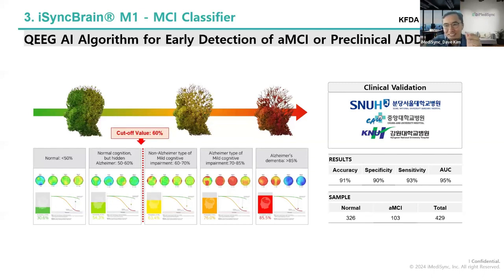So it is not easy to say this parameter makes this value in the current model. I understand your perspective as a clinician. It's very difficult to give the explanation and association of the EEG pattern and MCI result.